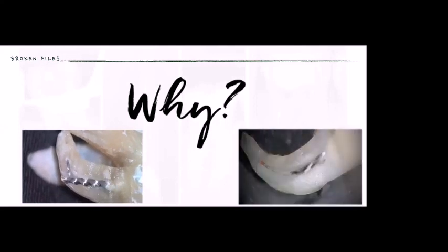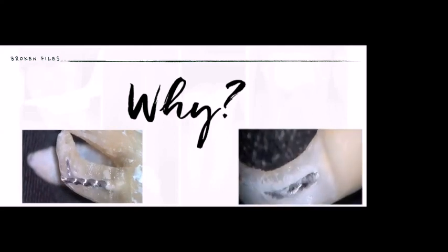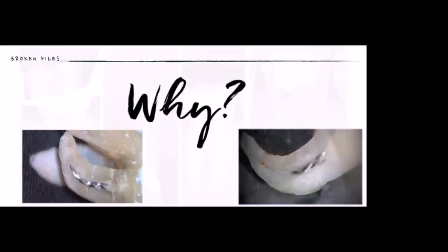But there are some disadvantages. One of them is that we can break the instrument inside of the root canal. So in order to decrease the number of fractures, we are going to review the basics of these NiTi alloys.